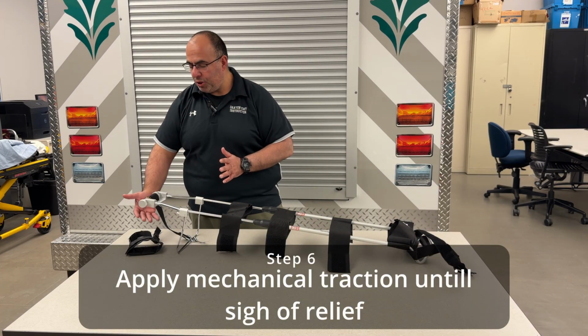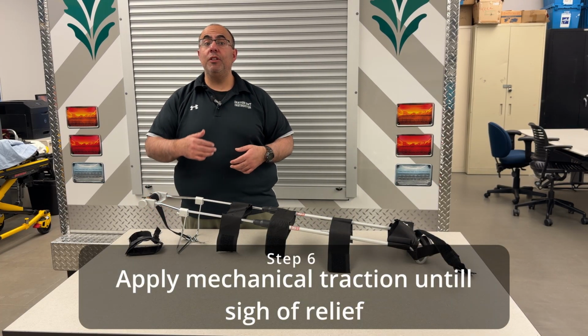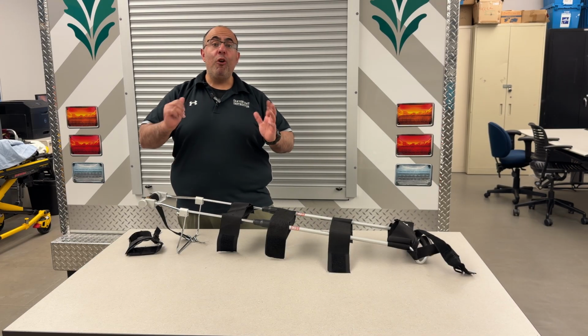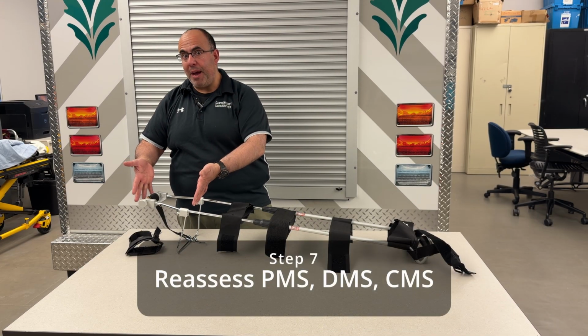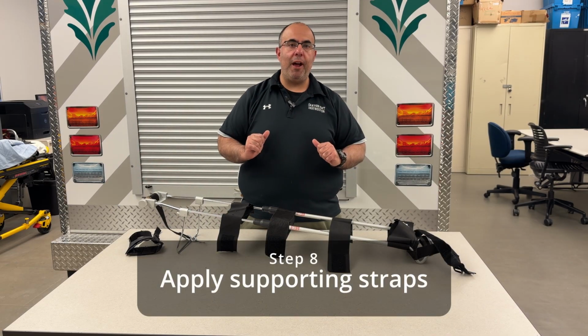I go straight down to the mechanism. I apply that mechanical traction until the patient sighs with relief. From there, I reassess my PMS, DMS, CMS, and then I apply my supporting straps.